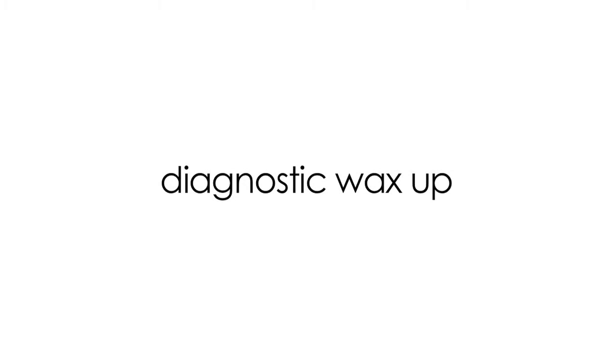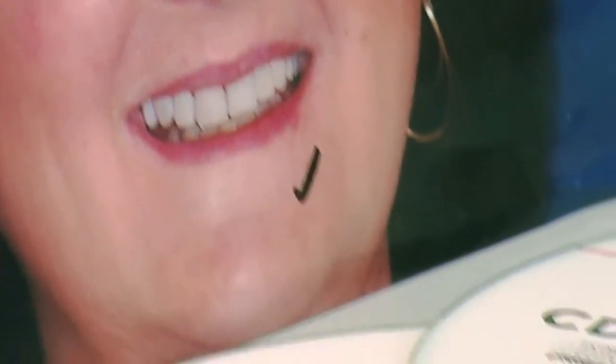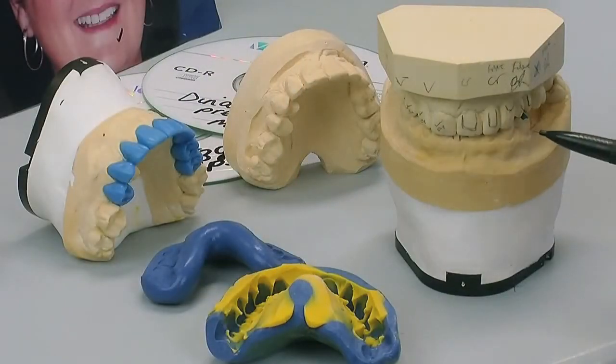All the information is coming to the lab and we're going to start to do our diagnostic wax-up. Effectively, we've read all our tickets, we've got information, we've got our CD-ROMs, we've discussed it with the dentist. This is the pre-operative model now.